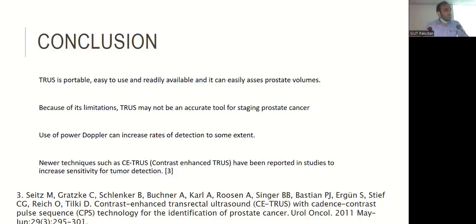And it's not experimental. It is not only discussed, but has also been widely addressed in the literature. Both these techniques, the nano-bubble and the CEUS, are now discussed on platforms like ASCO. Nothing else is needed, just another kind of contrast medium which can be injected and can concentrate on the area where you want it. It has many other purposes beyond the prostate also.